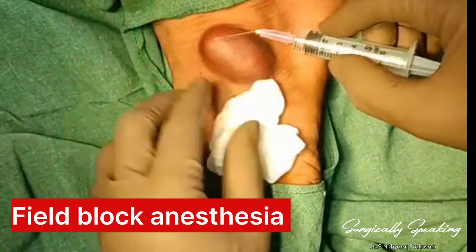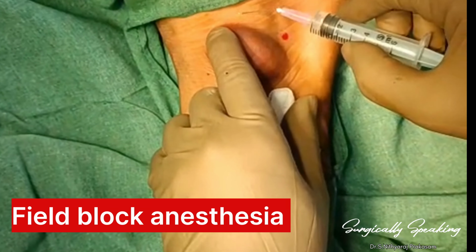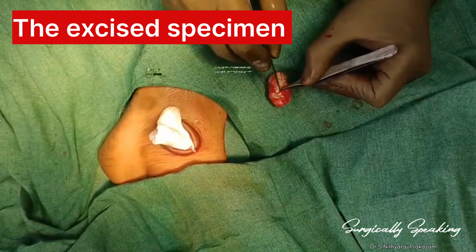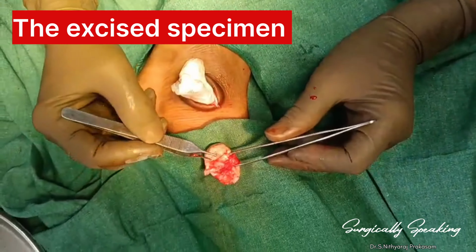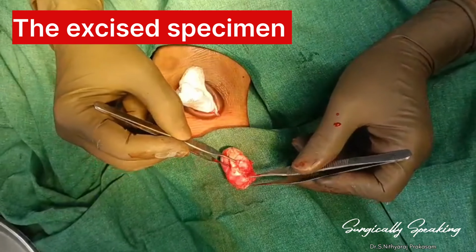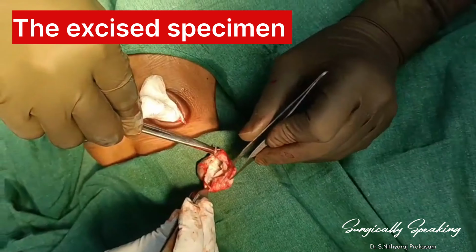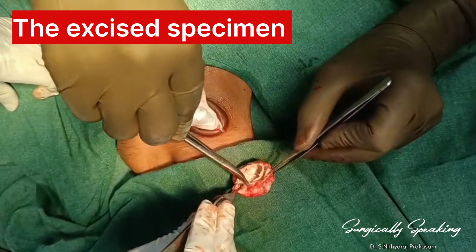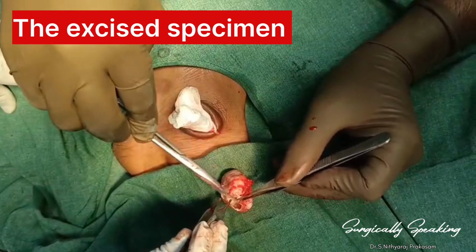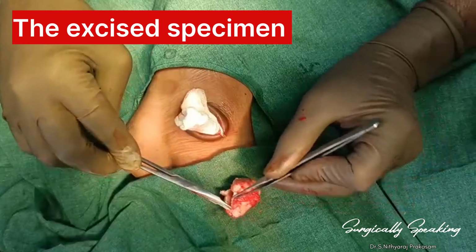So see, all around I have injected and I'm raising a wheal. This is the cyst. There's a cyst which I have removed, and I opened it. See, we have opened the cyst. The contents have been removed, and this is the entire capsule. So my diagnosis was right. It is an Adventitious Bursa, and this is the entire cyst.